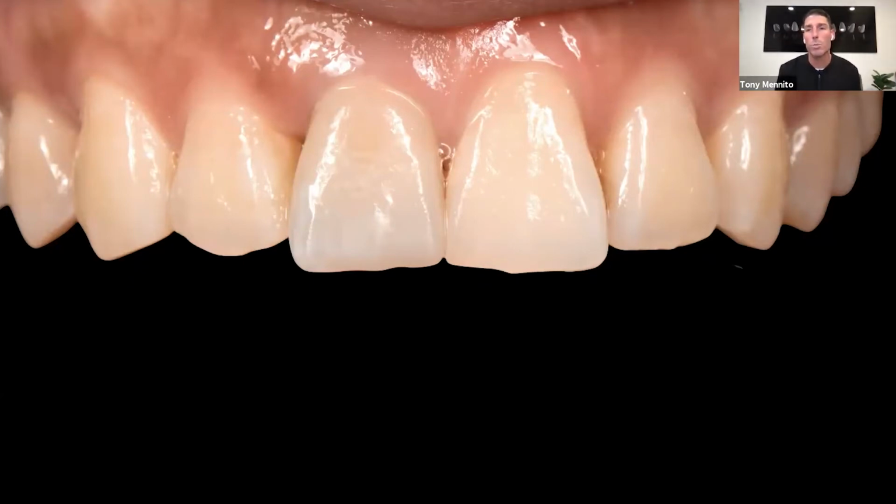And I always schedule more for single centrals because you never know that you're going to need a little extra time for maybe a second fire. But look at this result. I mean, this is a beautiful, beautiful case. Was really pleased with this.